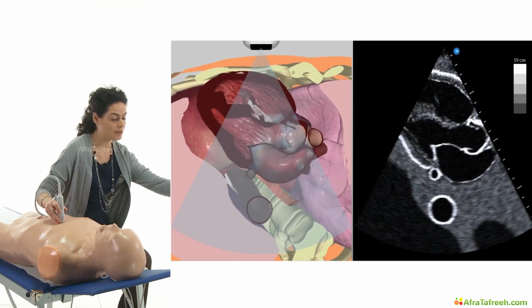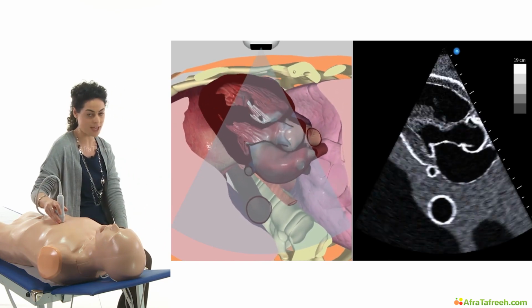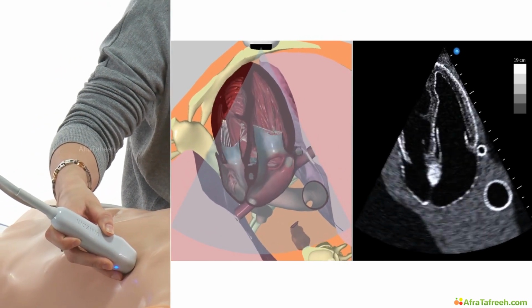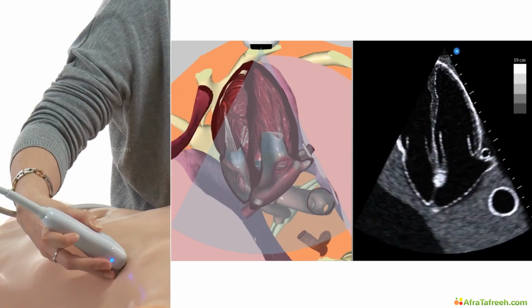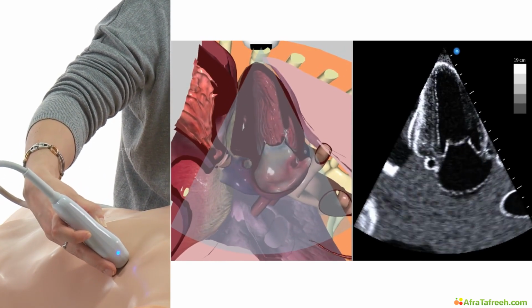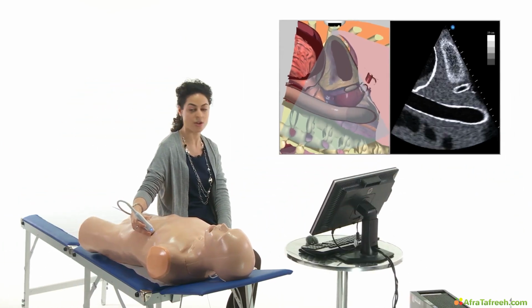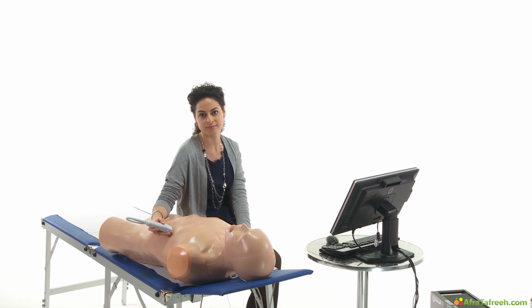Here's the first one, still parasternal long axis view, in the short axis, right posteriorly to the left atrium. And when we go to the four-chamber view, apical, here it is again, descending aorta lateral to the left atrium, and in the two-chamber view, we can appreciate the long axis of the same portion of the aorta just by tilting the transducer a bit. And here it is. So actually a few views which allow you to recognize different segments of the aorta.